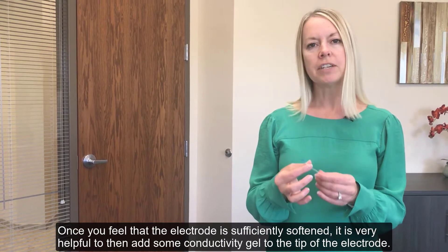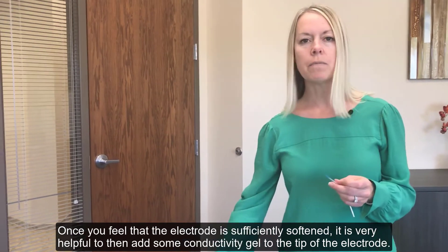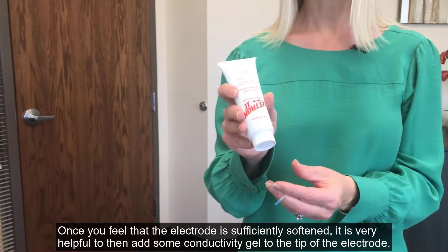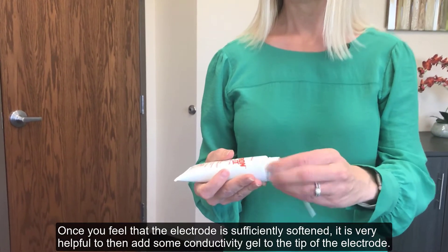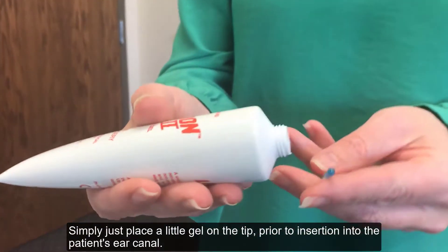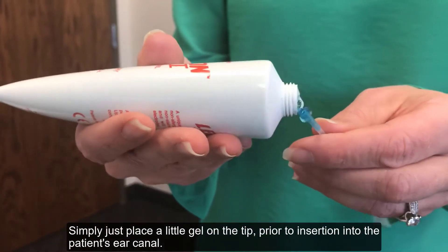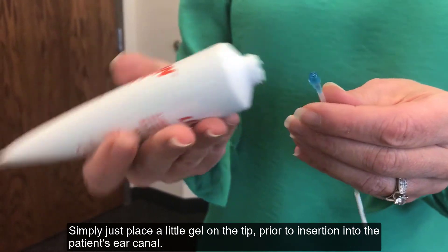Once you feel that the electrode is sufficiently softened, it's very helpful to then add some conductivity gel to the tip of the electrode. Simply place a little gel on the tip prior to insertion into the patient's ear canal.